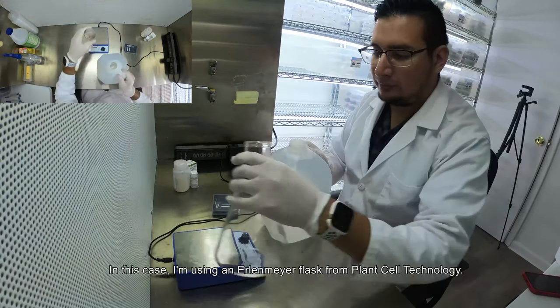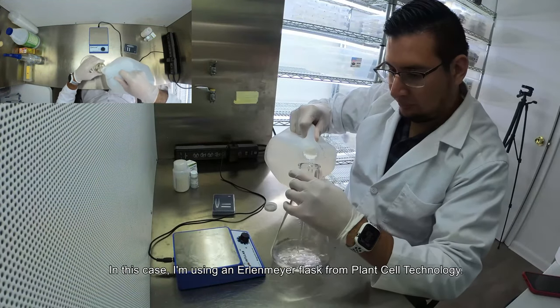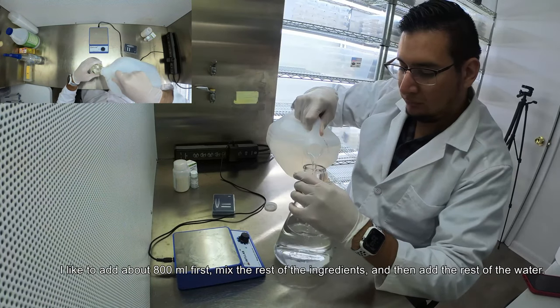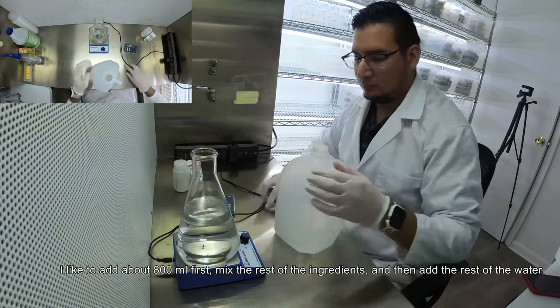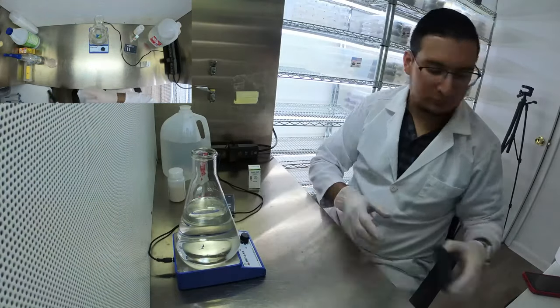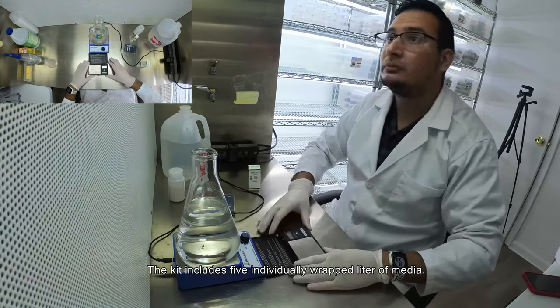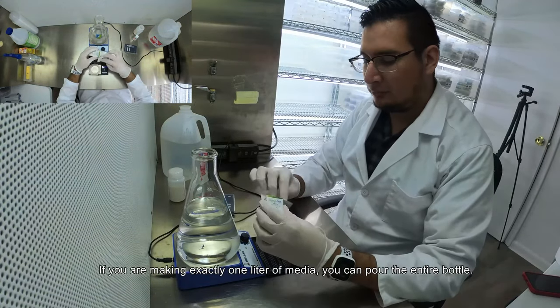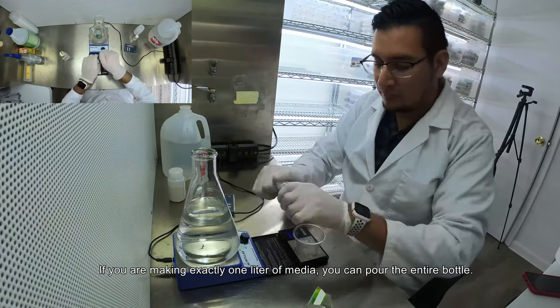In this case I'm using an Erlenmeyer flask from Plant Cell Technology. I like to add about 800ml first, mix the rest of the ingredients, and then add the rest of the water. The kit includes five individually wrapped liters of media. If you are making exactly one liter of media, you can pour the entire bottle.